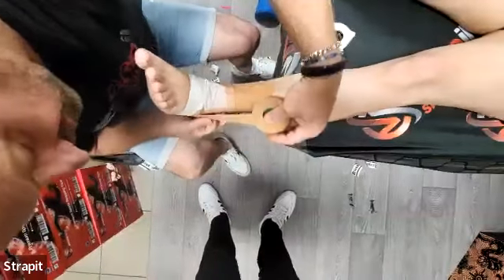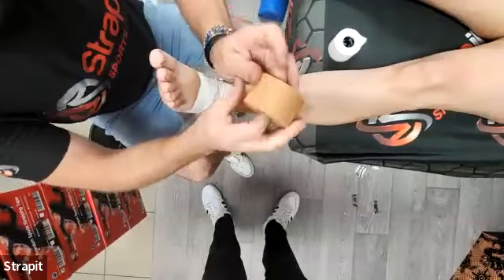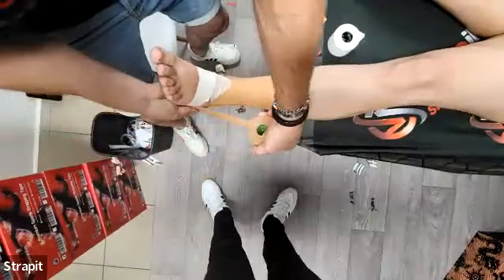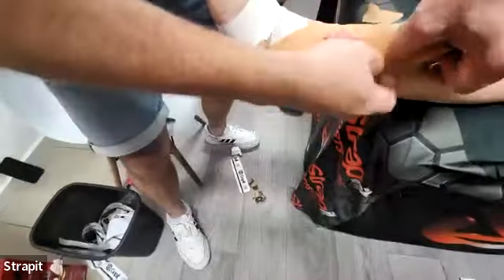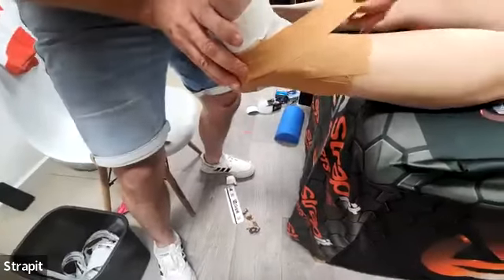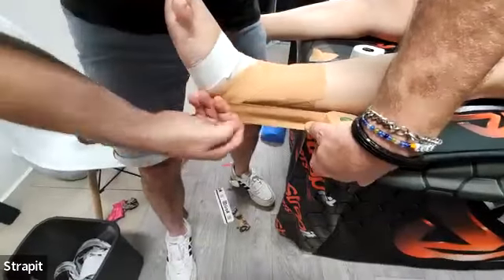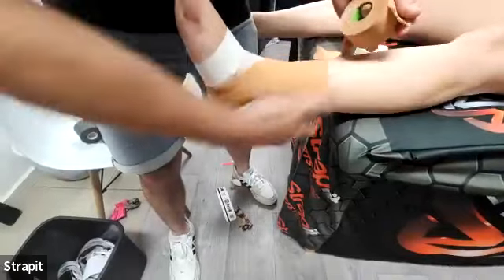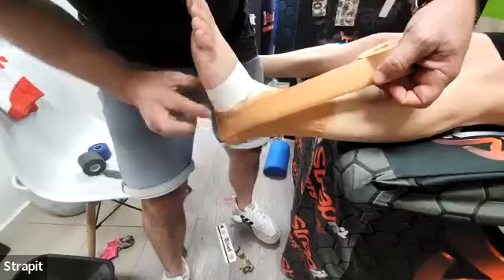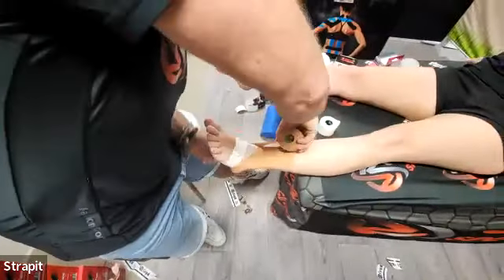You can add two or three stirrups. You can do a figure-six and a reverse six. This rigid tape loves to stick to itself, so you don't always have to go all the way around and bulk up. If you're going after that lateral ligament complex, which is normally more commonly injured than the medial, you don't have to go all the way around — you can create these really nice lines of pull. You can even go posteriorly like a calcaneal sling to create greater posterior support for the subtalar joint. Watch the fifth metatarsal base — don't hit that fifth met or the patient will want to punch you. If you want to invest medially, add a couple of sixes on the medial side to lock that up.